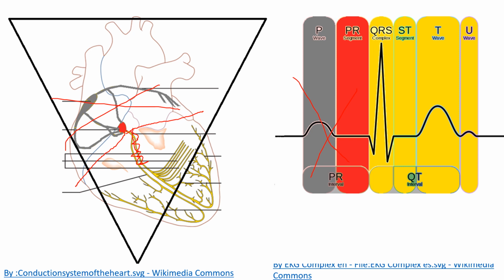And so what's happening is electricity is coming from somewhere down here. So we're not using this nice normal His-Purkinje system, and so we're not going to produce a nice normal QRS, right? Instead, we may be starting here. We're going to be starting somewhere, but once again, it's just like that atria.